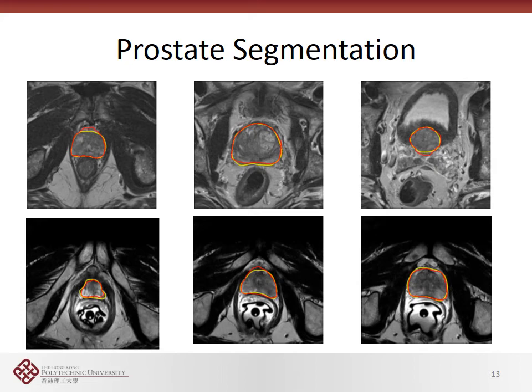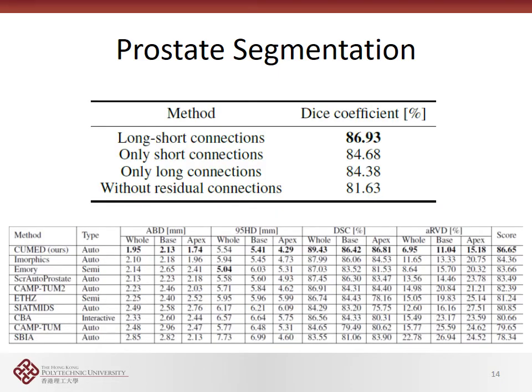But you can see that in most parts of the boundaries, the automated segmentation results and the ground truth are quite consistent. This somehow demonstrates the effectiveness of the proposed deep learning model in prostate segmentation from MR images.